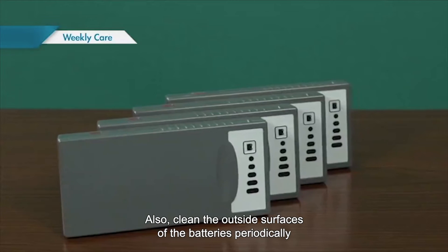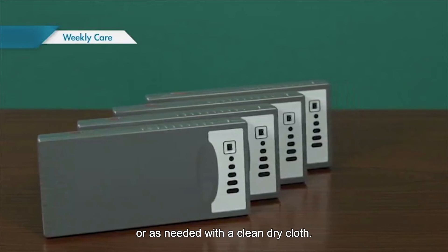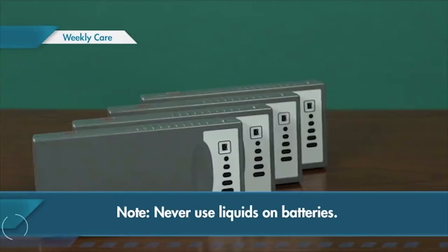Also clean the outside surfaces of the batteries periodically, or as needed, with a clean dry cloth. Never use liquids on batteries.